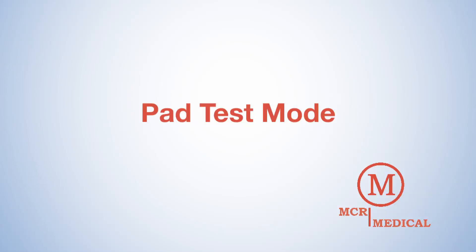Wondering if it's time to replace your Preston Professional AED training pads? Finding out is easy with the unit's pad test mode.